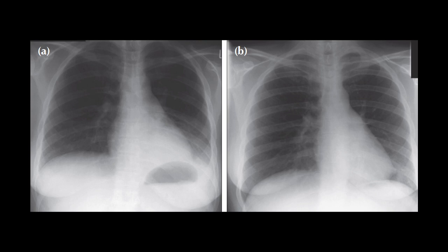Today I'm going to teach you one important thing that you have to look at in every chest X-ray. This sign involves looking at the cardiac borders of the heart and the dome of the diaphragm. Here are two X-rays.